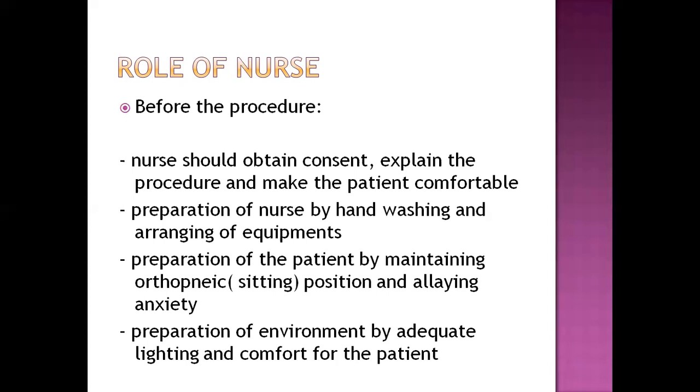Nurse can prepare environment by providing adequate lighting in that examination room, because patient has to visualize something and answer the question asked by the nurse. So nurse should make sure that that room has enough lighting so that patient can see whatever nurse shows to the patient.